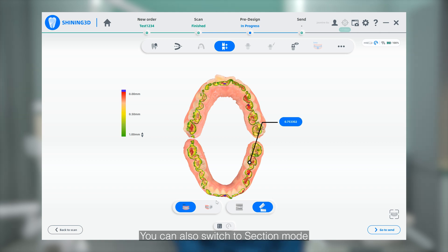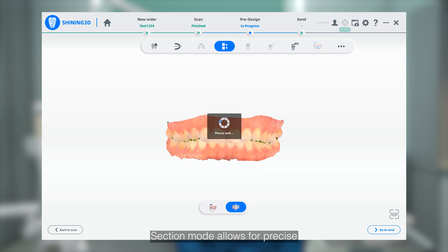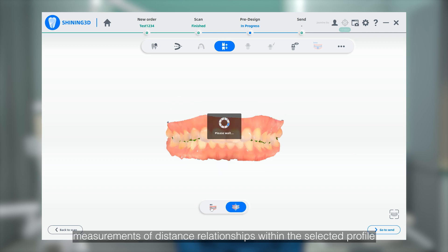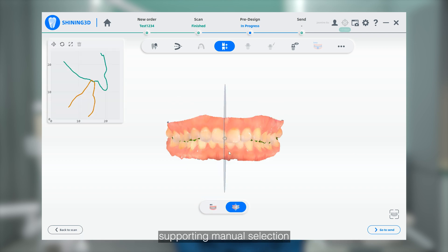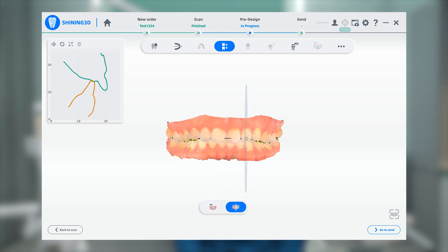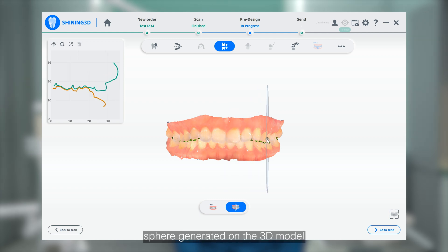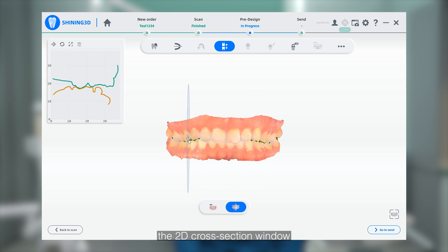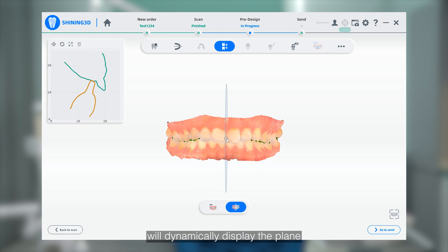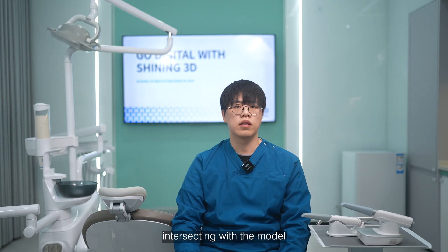You can also switch to section mode. Section mode allows for precise measurements of distance relationships within the selected profile, supporting manual selection of any two points for measurement. By holding the center surface generated on the 3D model and translating left or right, the 2D cross-section window in the upper left corner of the interface will dynamically display the plane intersection with the model.